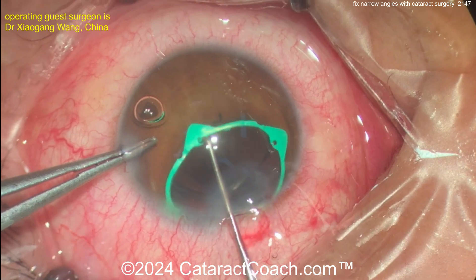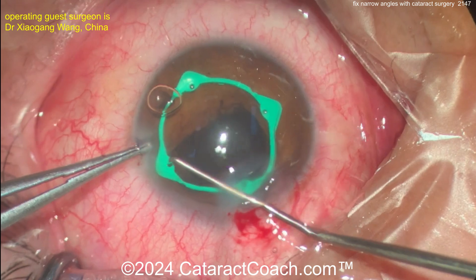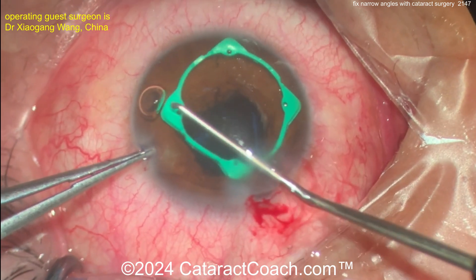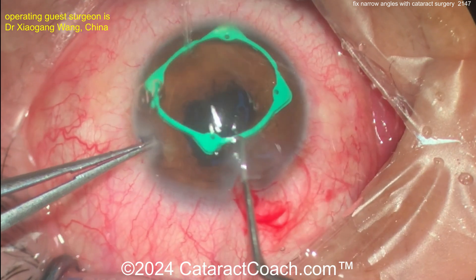Laser peripheral iridotomies may not be necessary, and we now know that's not such a perfectly benign procedure — like any other procedure, it has some risks. Now taking that ring off very gently — beautifully done.